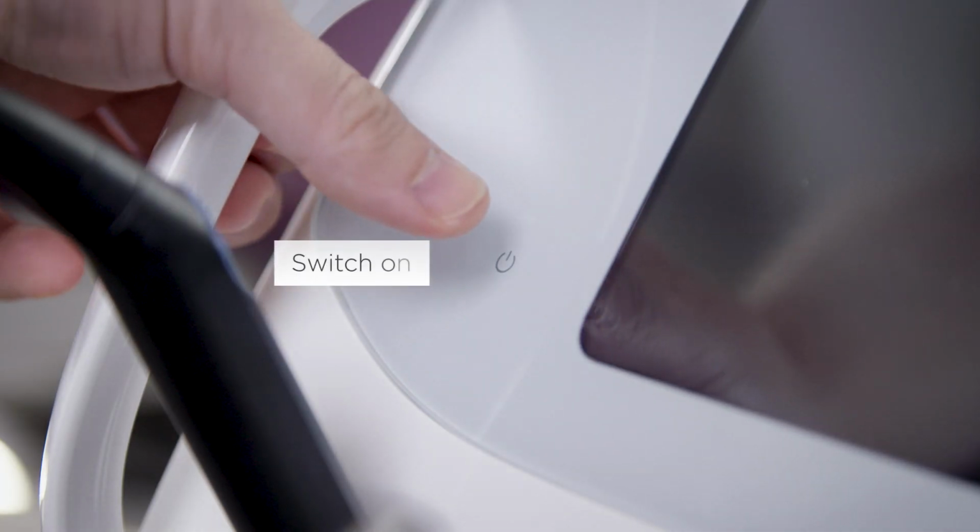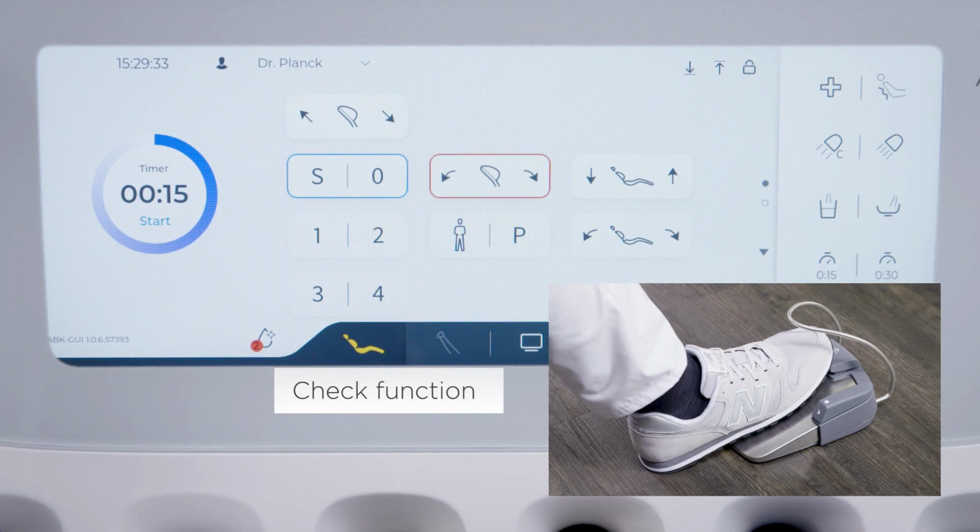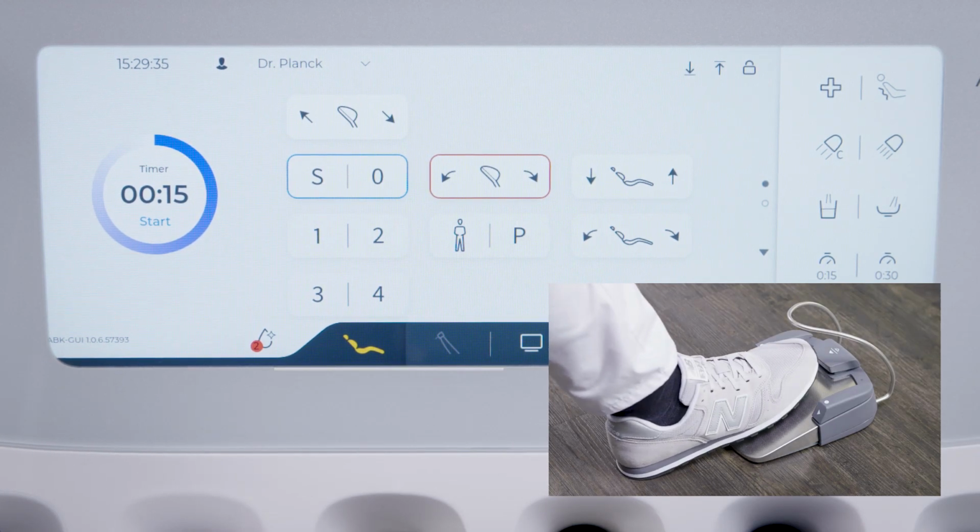Switch Axano on again after replacing the battery and check its function. You do not need to log into Smart Control again after battery replacement. You can continue working immediately.